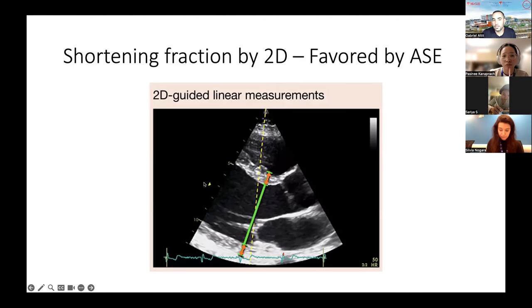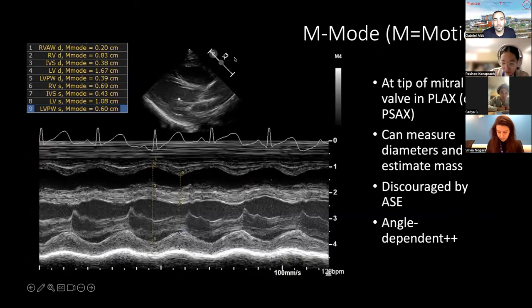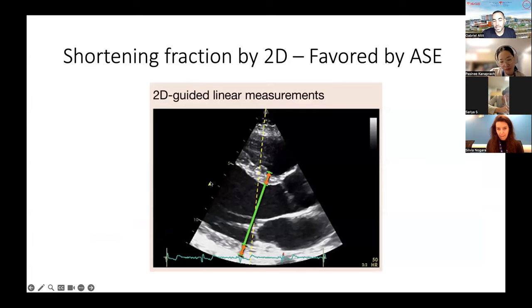I just want to point out that in this particular older scan, there is a focus. So it's very important to adjust your focus when you do imaging. In the Philips, you can see the focus is here. Typically, in this particular view, you would have liked to drop it down, because you want the focus to be on your left ventricle, since most of the information you're getting for this M mode is on the left ventricle. So here, if I were to criticize my own images, I would bring down the focus. And in here, you can see that they rightly did. They've put the focus on the LV.